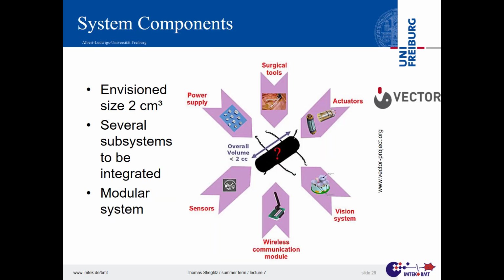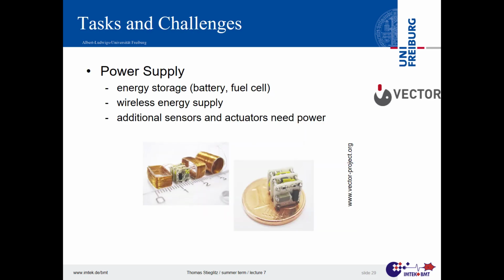And this brings all those things together, what would be needed. So it's power supply, surgical tools that fit the environment, actuators, a vision system, the communication and sensors. All really cool, a playground for microsystems engineering, embedded systems, so whatever you need you could put in. But it's really challenging with the assembly and with the interaction at the end with the intestine. And there are many more approaches of cool inchworms that go somewhere.